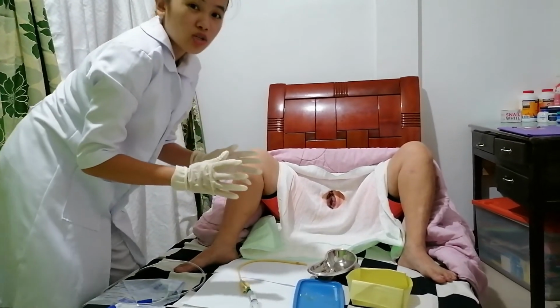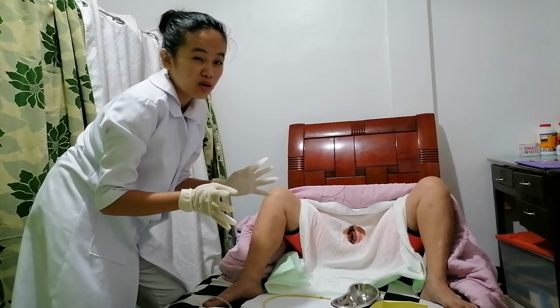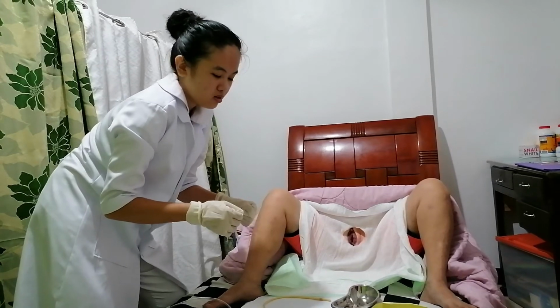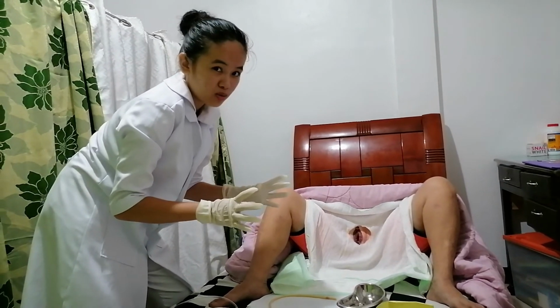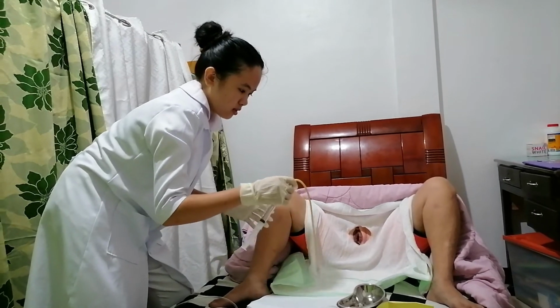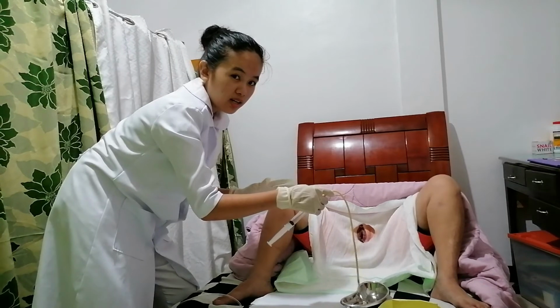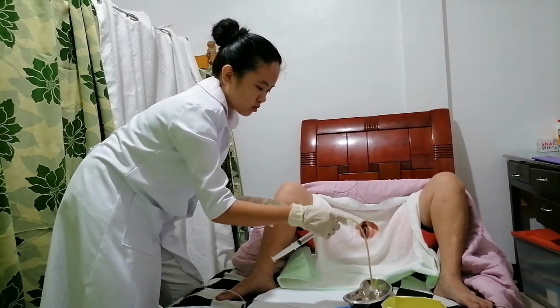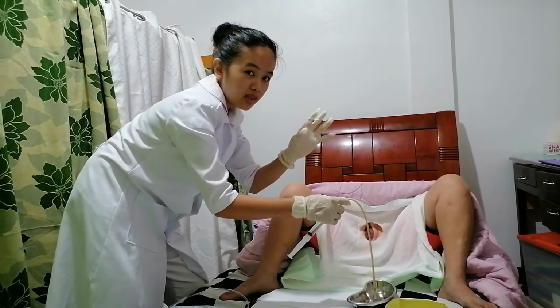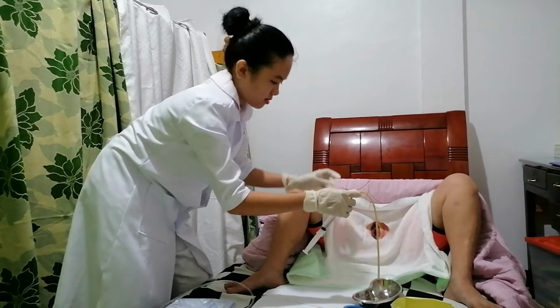In some institutions, they prefer to test the balloon first, but for now, I'm not going to test it. So, I'm going to proceed into putting this catheter in lubricant easy jelly, and then I'm going to use my non-dominant hand to touch the meatus of the patient.